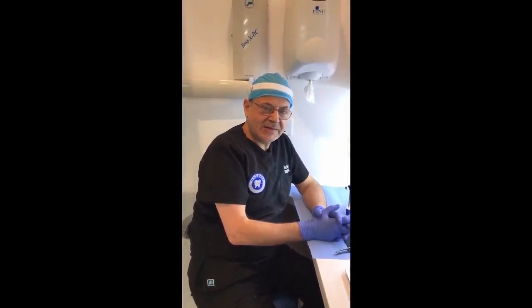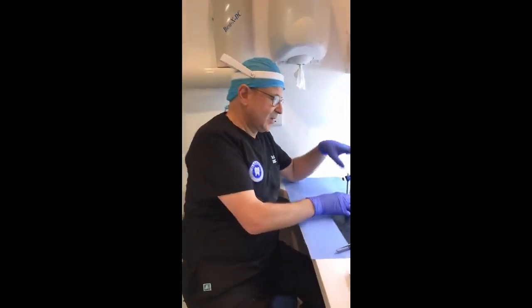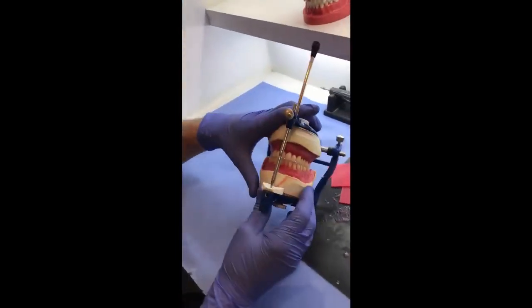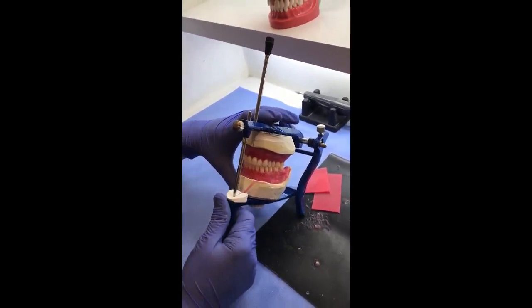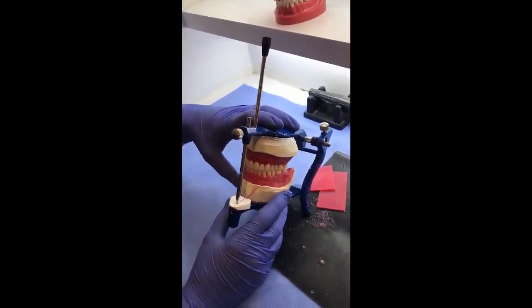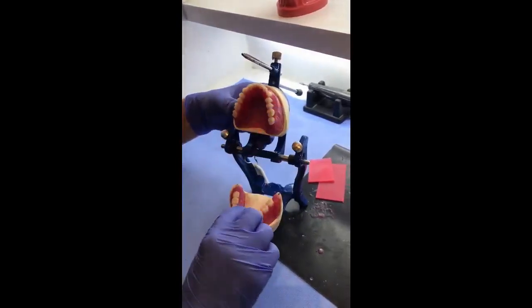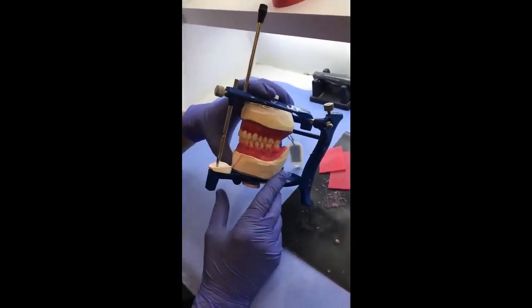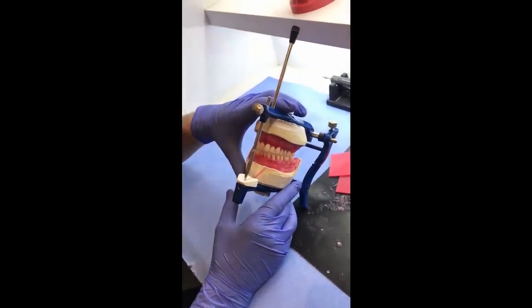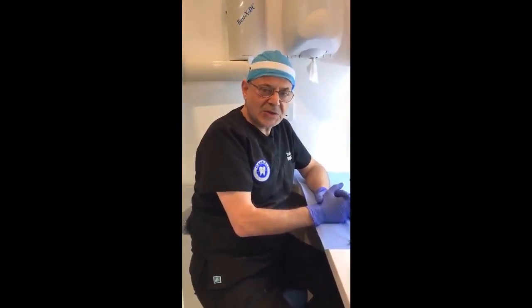Arranging the artificial teeth, and at the end of this stage, the teeth must be clean and the wax around them must be smooth. Now, we have to verify our setting. We have to check the jaw relations and check the teeth and other criteria inside the patient's mouth. Therefore, we have to be able to remove the setup from the cast. So at the clinic, we can put it inside the patient's mouth and check the jaw relations registered on the articulator, check the arrangement of teeth, and check the phonetics, and this is called the try-in stage. It's a very important clinical step which will be explained to you during the lectures.